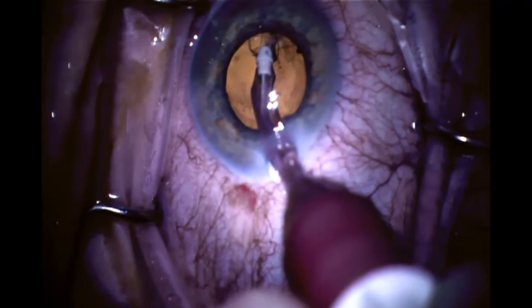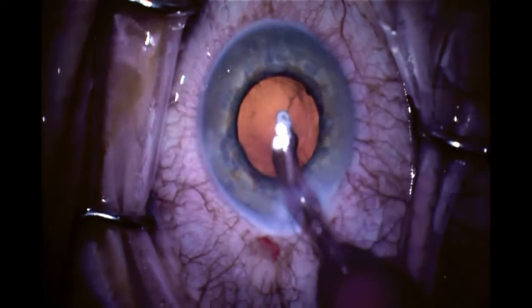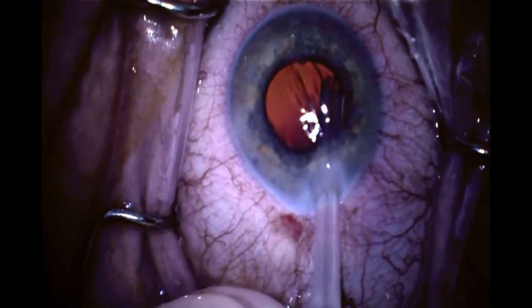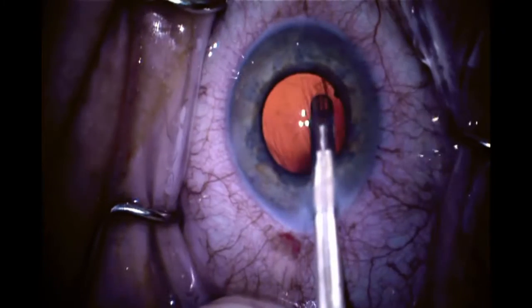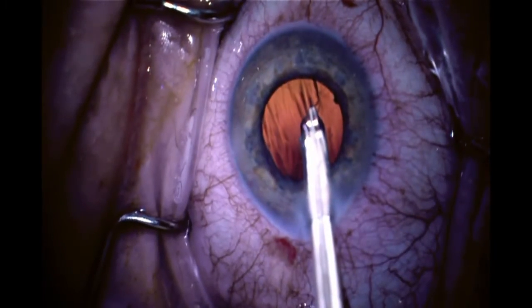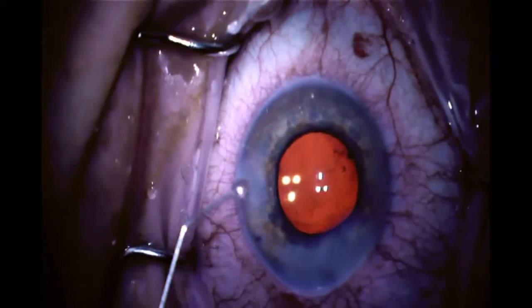Here you can see as we're finishing up the cataract extraction. Given his high myopia, there's a lot of redundancy and floppiness of the capsular bag, which is somewhat disconcerting as we're removing the last bit of cortex. So we make the decision to insert a capsular tension ring, which you see here. These are the preloaded capsular tension rings that come out to the right or to the left. Given the diffuse floppiness of the capsular bag, the direction does not matter. Once we finish inserting it, you can see that the lens centers nicely and remains quite stable.